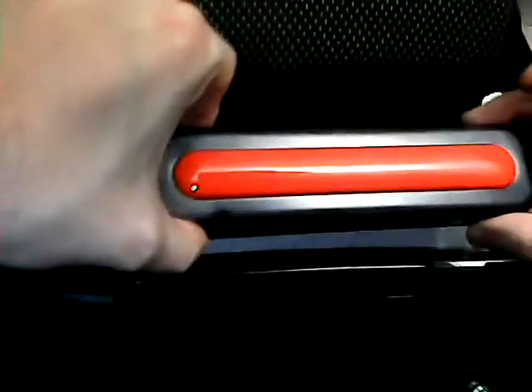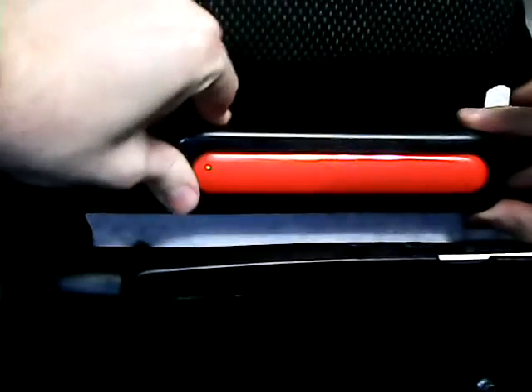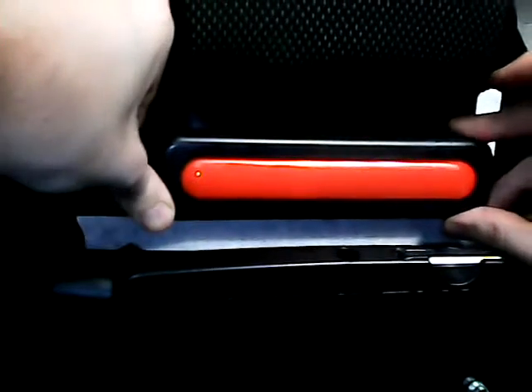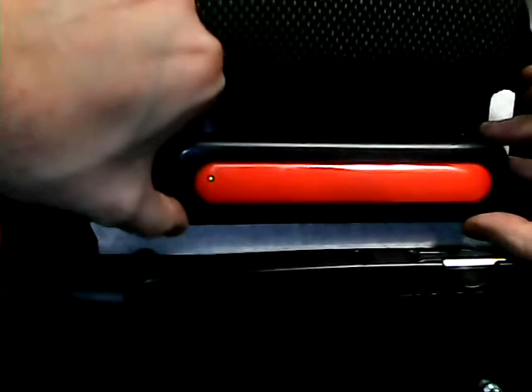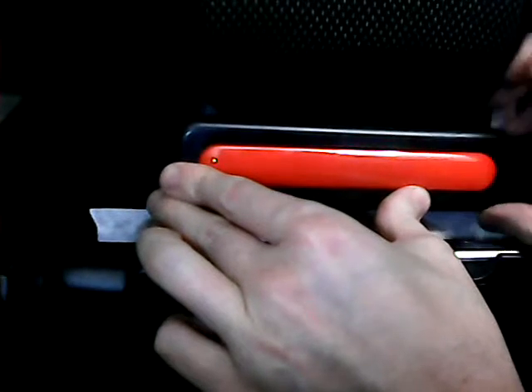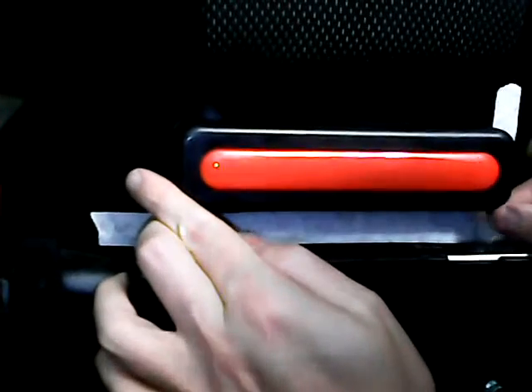So I've now given the PL 9000 time to get tacky. So here's where it will be permanently positioned, and I'm just lining this up with the tape that I added to the wheelchair, and it just so happens that the red part of my light here is only a fraction of an inch wider than that opening. Okay, and that's where I want it to live. Now if I can just conceal that little bit of PL right there. There we go. Okay, and I'm just straightening it out.